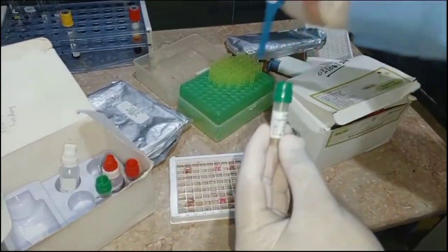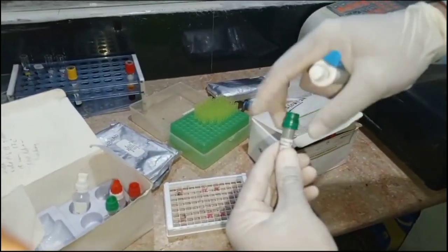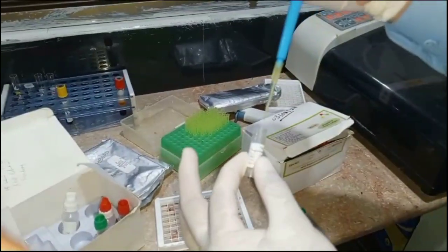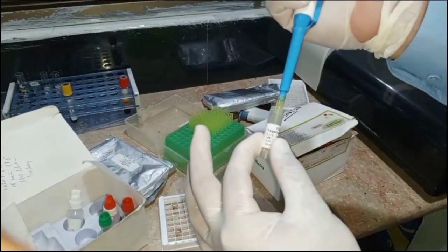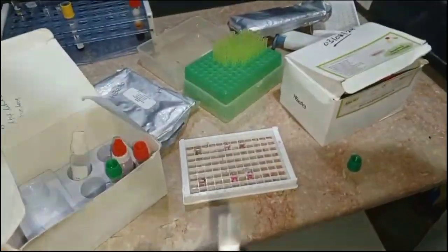We can also say that the positive control or negative control contain a known sample, meaning the positive will have a known positive sample and the negative has a known negative sample.